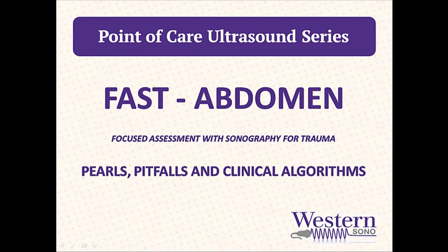So this concludes our introduction to point-of-care scanning techniques of the abdominal FAST exam. Be sure to review the next screencast in this series where we will review the clinical applications, pearls, and pitfalls of this study. You can find all of these resources at westernsono.ca.